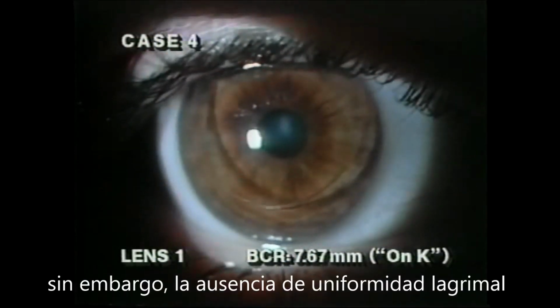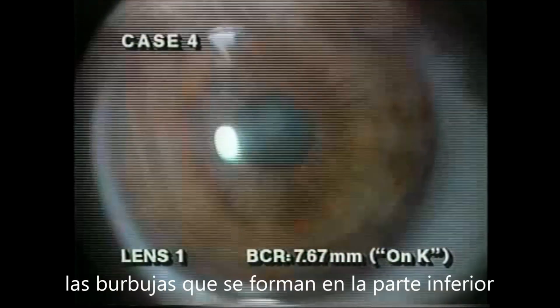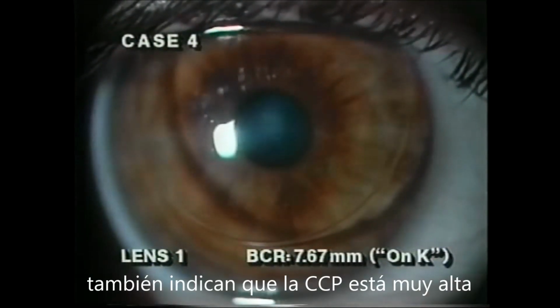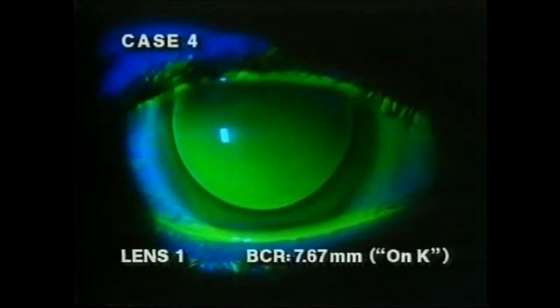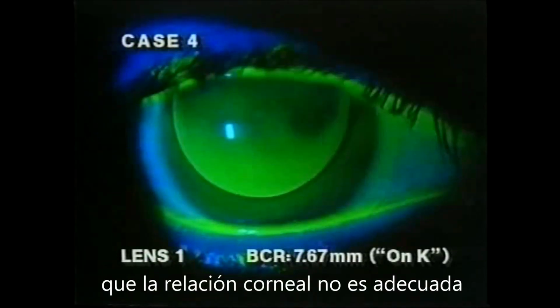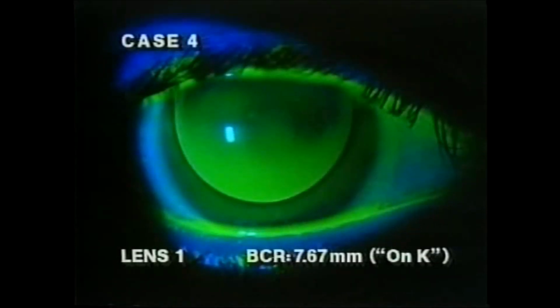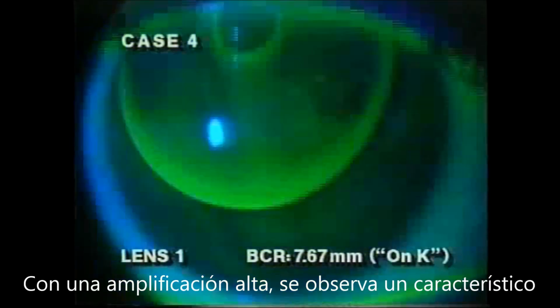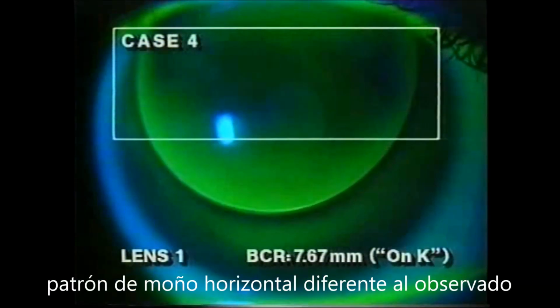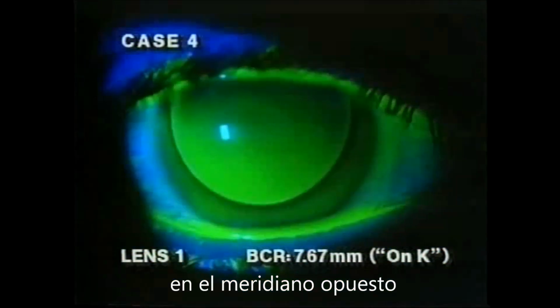However, the absence of an alignment fit is indicated by excessive shifting of the tear layer with the blink. Bubbles observed inferiorly also indicate excessive edge clearance. Fluorescein evaluation confirms a less than ideal fitting relationship. There is superior bearing with excessive inferior edge clearance. At high magnification, the characteristic dumbbell pattern can be observed with vertical clearance and horizontal bearing.